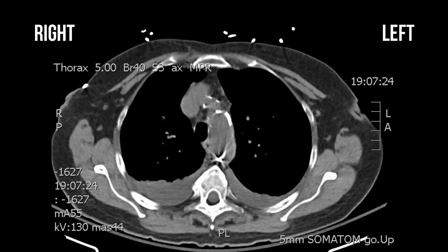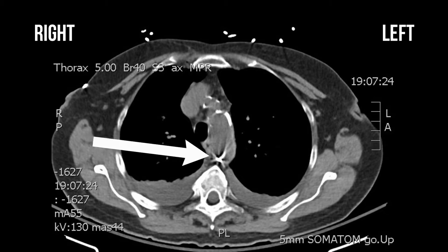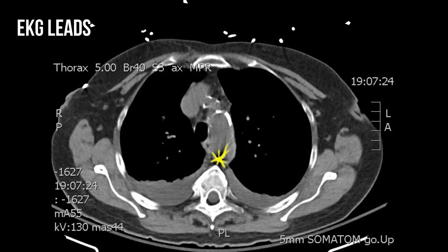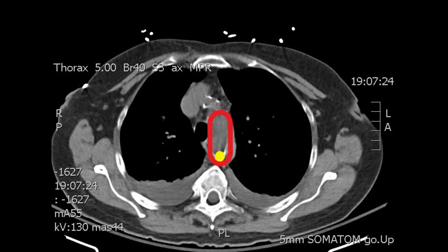CT of the chest. Here we're going to see from top to bottom. You can see the upper marker of the balloon pump shown by the arrow. You can also see all the artifacts generated, shown in yellow, and the arrows at the top are just EKG leads.